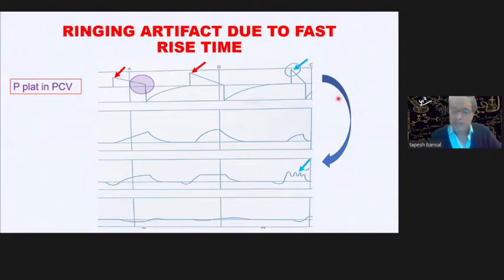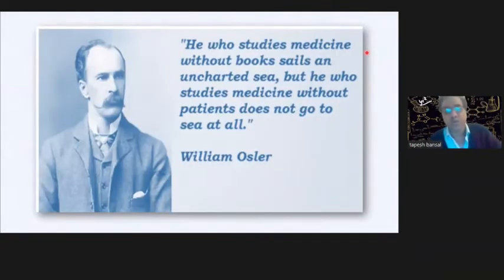So that, I think, was the waveforms I wanted to show you, just a bird's eye view, and hopefully you would have found them useful. But please remember that you have to integrate everything. You have to read, you have to see the waveforms at the bedside, and you have to ask your seniors. And there is no better teacher than the patient and the ventilator at the bedside in the ICU.